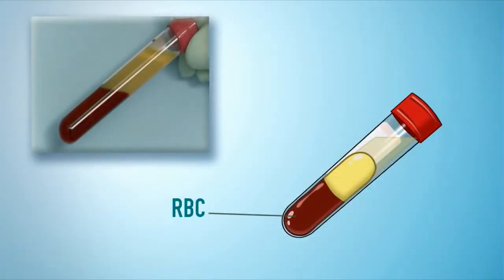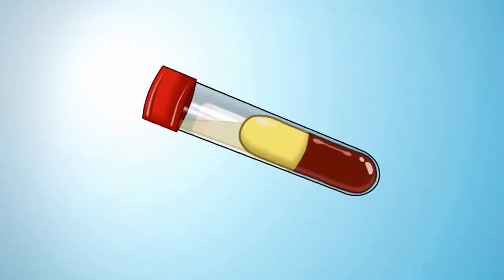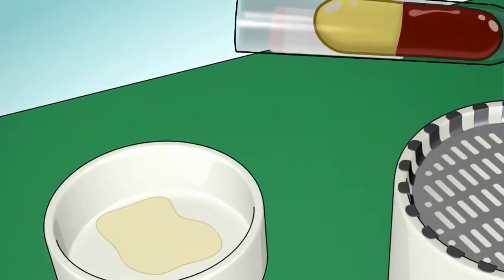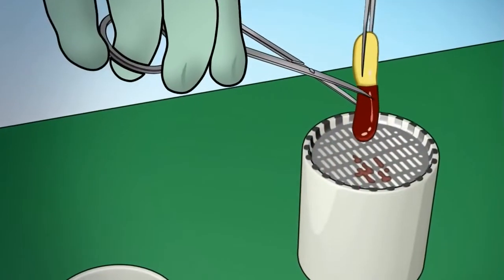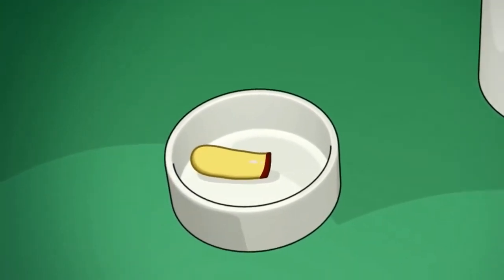The three phases are: RBC (red blood cells), CGF (concentrated growth factors), and PPP (platelet poor plasma). For each tube, carefully remove the PPP to be used later. Then put the other two phases into a container provided with a grid drain to separate RBC from CGF, and put the CGF into the sterile container.